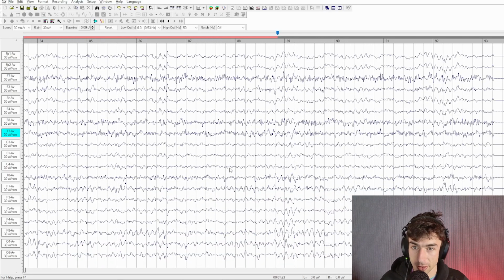Wow, and we are already at the end. So, very brief recording, and by the end, it looks like the left side is also lighting up with some EMG. We're seeing it at F7 and T7 now, whereas previously we were only seeing it at F8.